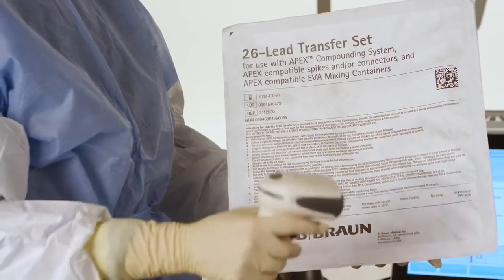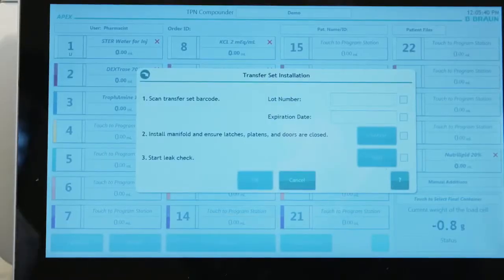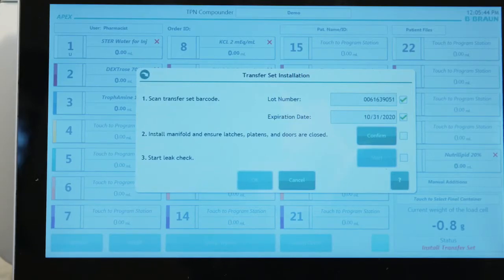Using the barcode scanner, scan the label on the transfer set package. APEX will populate the lot number and expiration date in the appropriate entry fields and add green check marks to the right.